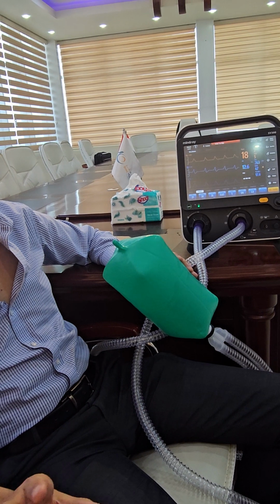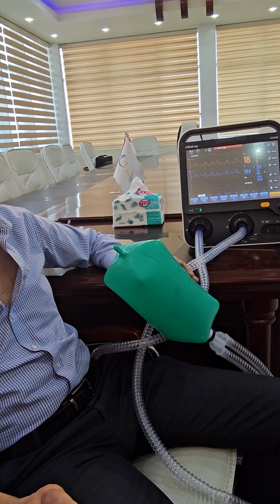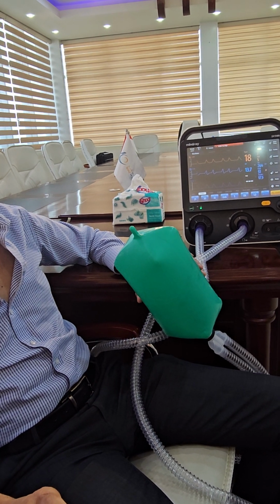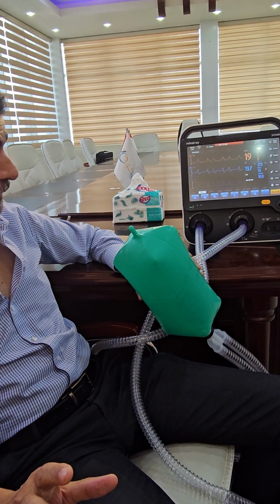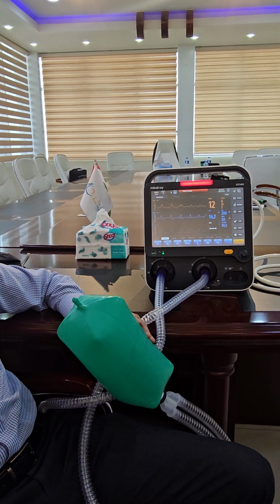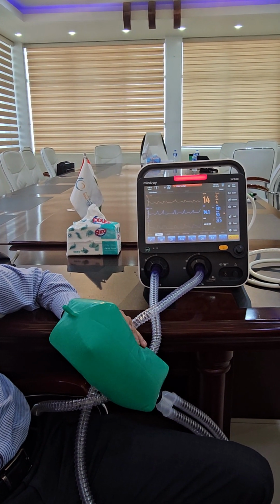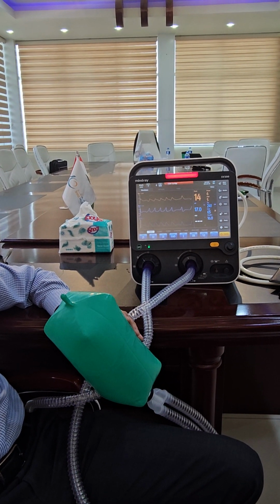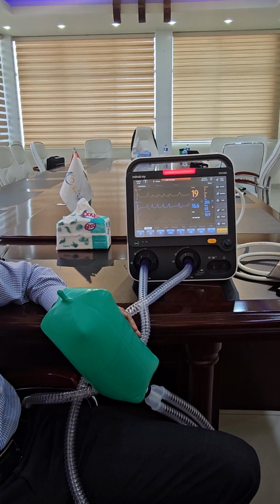Clear? Are these waves spontaneous or mandatory? This is mandatory, because it's not spontaneous, there's no difference. It starts regular, and until the ventilator gets used to it, it takes time. It becomes irregular. This is spontaneous. So this is spontaneous, this is mandatory.